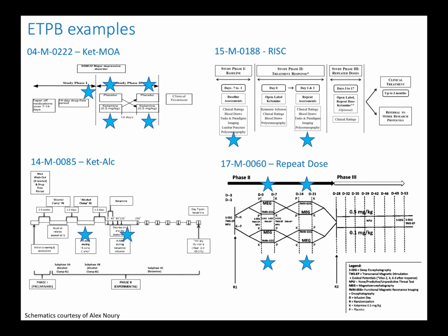So just a couple of examples from the group that I'm currently in. This one just finished up, and you can see how we're trying to integrate imaging into different arms of the study. Here's an example of a crossover design, and you can see the washout period is, in this case, 14 days, because ketamine is a pretty rapid-acting antidepressant. And we've got studies which actually have multiple different groups as well, and they know that they're getting treatments. We're also trying to do imaging during the infusion so you can actually see what's happening. And we also try to integrate different modalities at the same time.